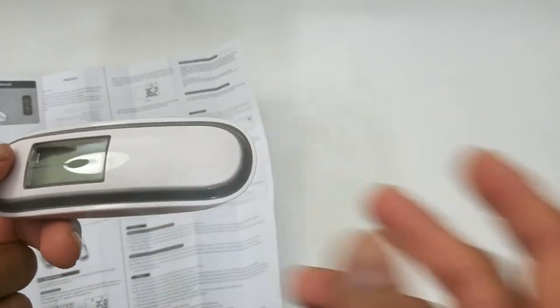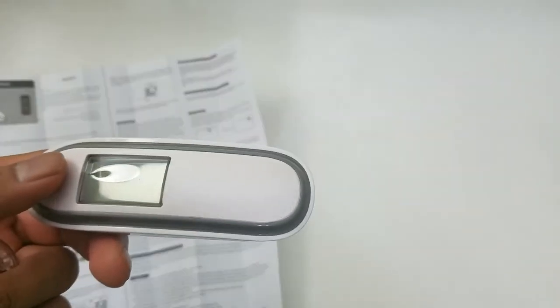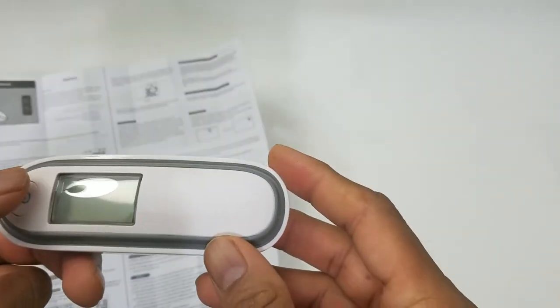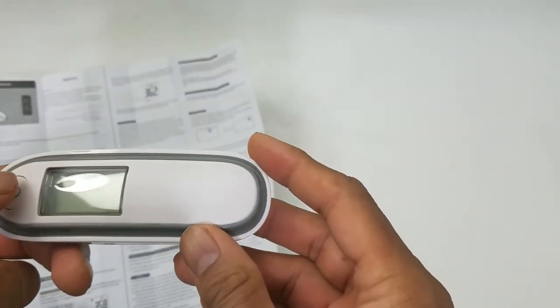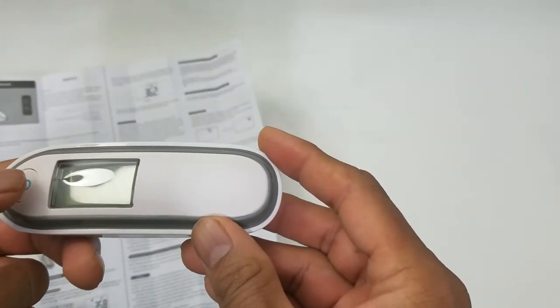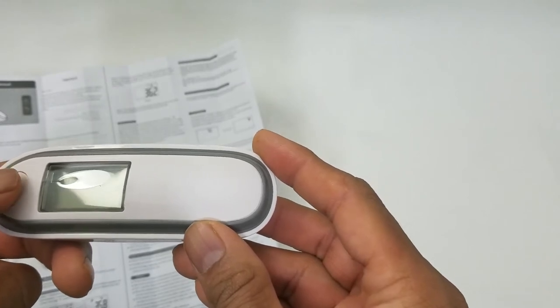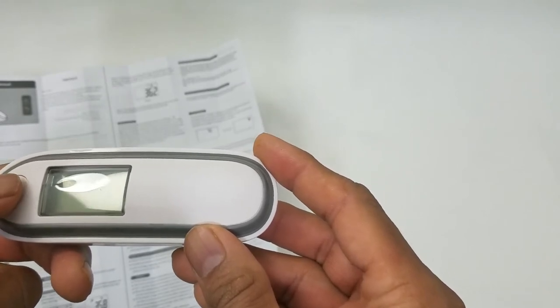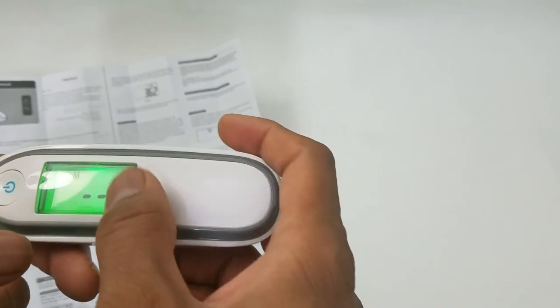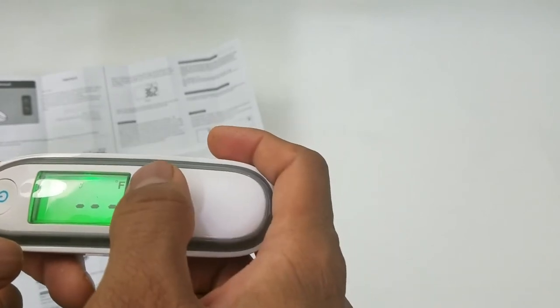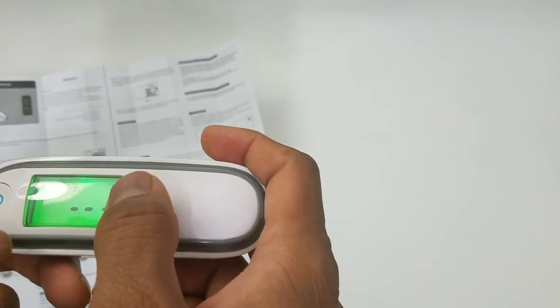To switch the thermometer between Celsius and Fahrenheit, just hold the power button down for three seconds and it will switch instantly to Fahrenheit.